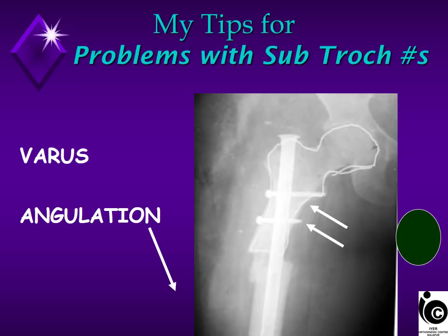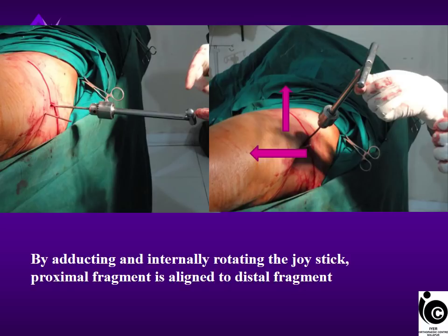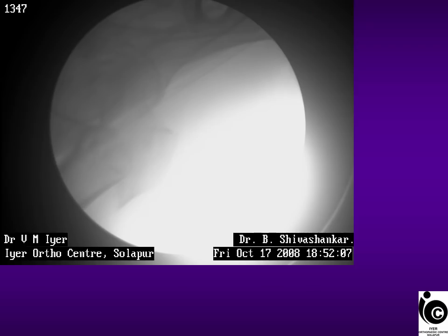Pass a Steinman pin into the proximal fragment and ask your assistant to adduct it by pulling it down. Then make an entry from the piriformis fossa and ream the canal. If you take care, then there shouldn't be any problem of flexion, abduction, or varus in these fractures. This is what I normally do. I pass a Steinman pin and ask the assistant to adduct and internally rotate when I make the entry.